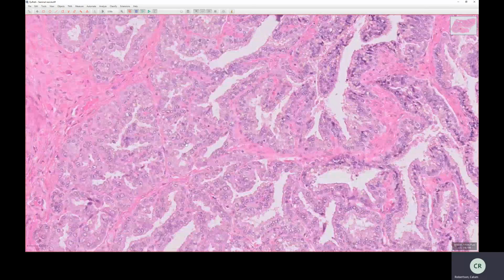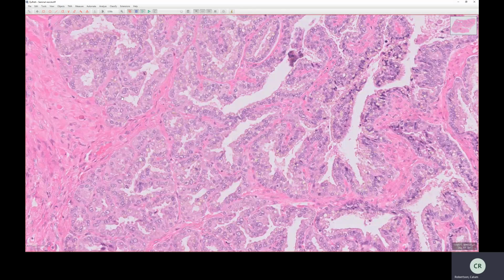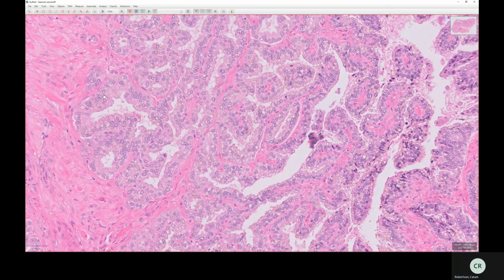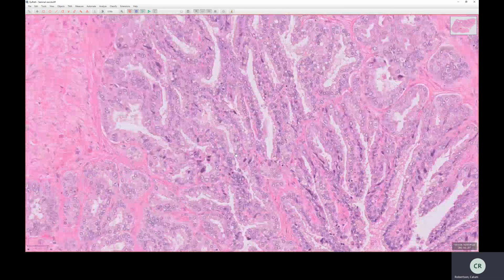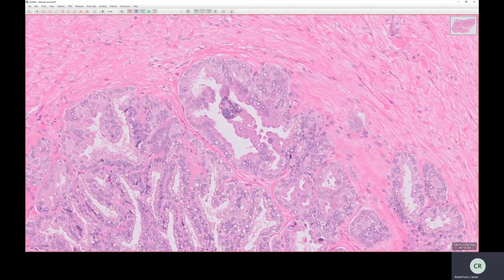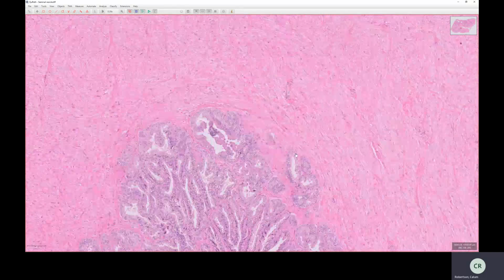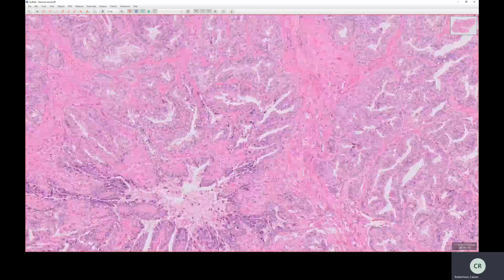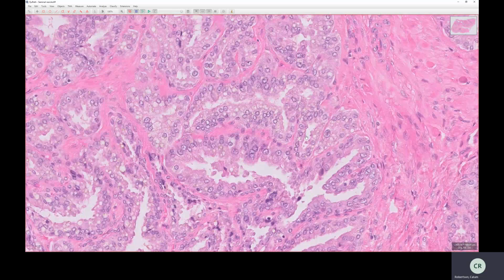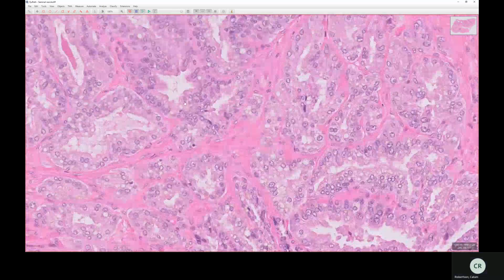And these nuclei, characteristically, nuclei are the purple bits. They're taking up purple splodges that are taking up hematoxylin. And the cytoplasm has that slightly pinkish purplish hue that's a bit lighter. So if you look at that nucleus and then compare it with that nucleus, which is much bigger, it's right next to a much smaller nucleus. And that's replicated throughout. If I look around, you'll see quite big nuclei of different sizes and shapes next to much smaller ones. So that's what we call nuclear pleomorphism, where the nuclei are all different sizes and shapes. And they're actually quite haphazardly arranged throughout the cell cytoplasm as well. It can make it look quite jumbled.